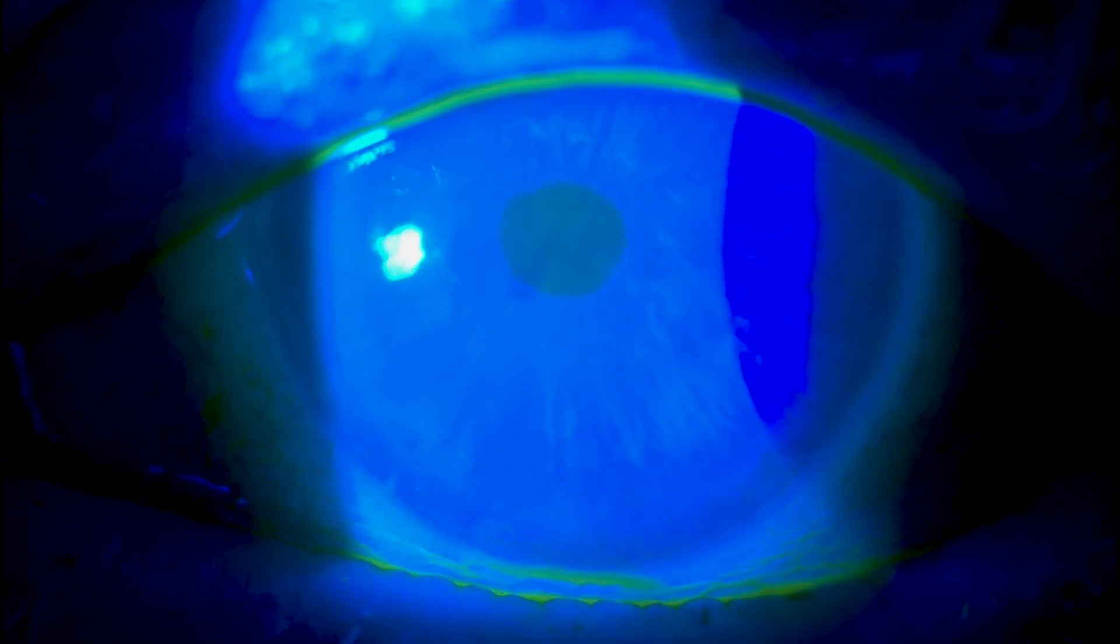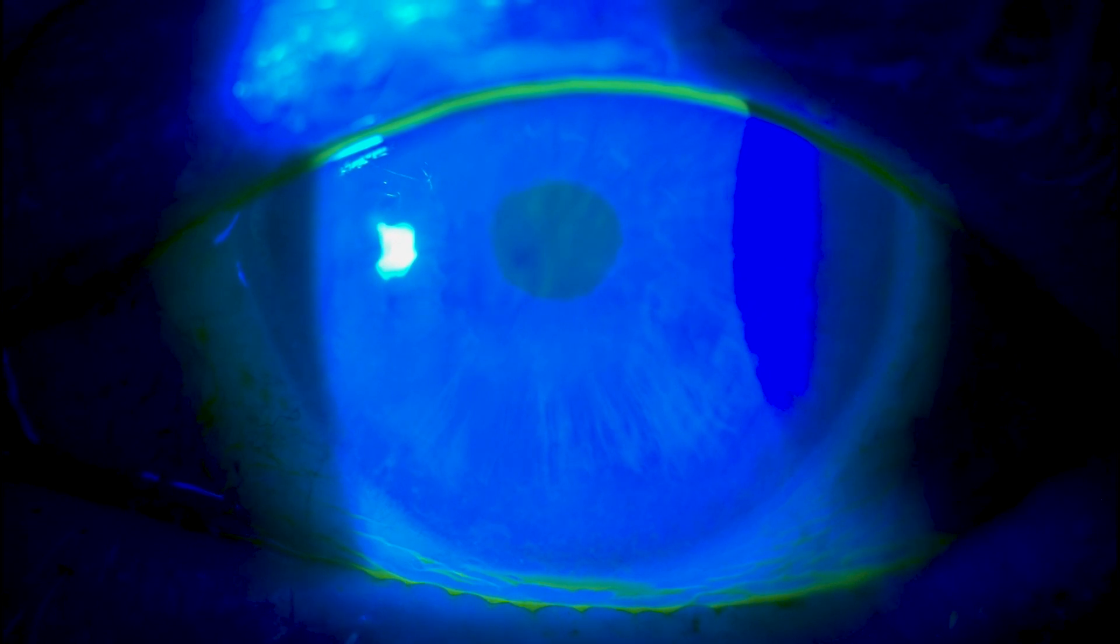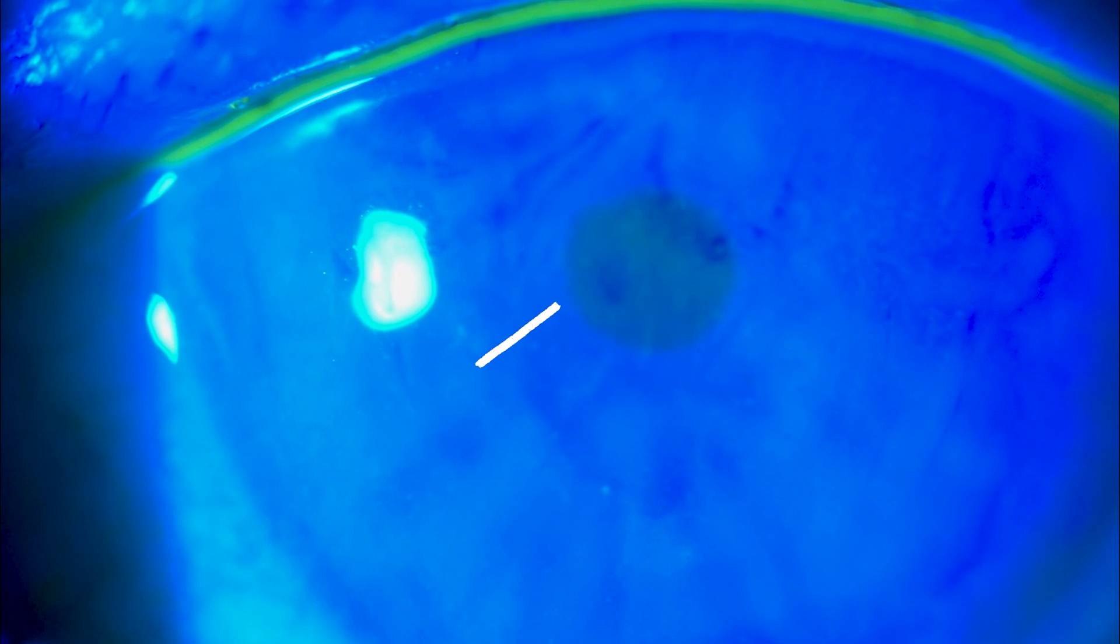And as you can see when she blinks, she has a nice yellow glow to her tear film, and it breaks apart. You'll see these almost black patches that form within the tear film.